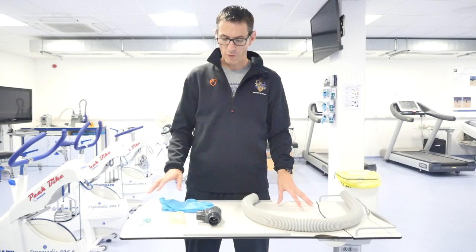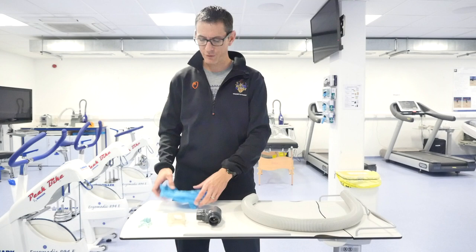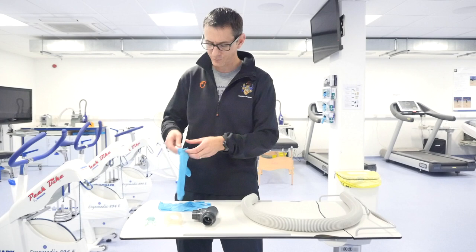Hello. This is just a little introduction on how to fit a mouthpiece together prior to collecting some expired air using the Douglas bags. I've got my equipment here set up ready: gloves, nose clip, one mouthpiece, a two-way valve system, and the tube that's going to connect the two-way valve system to the Douglas bags.